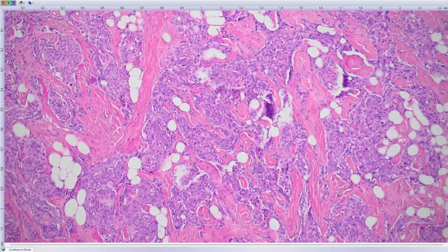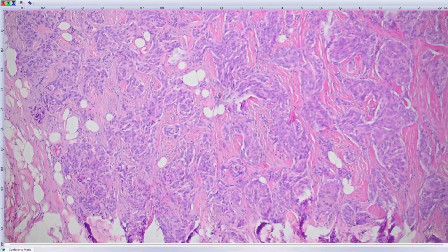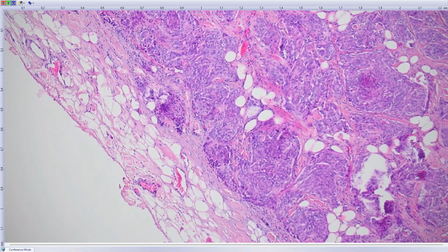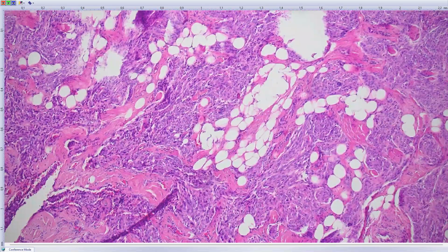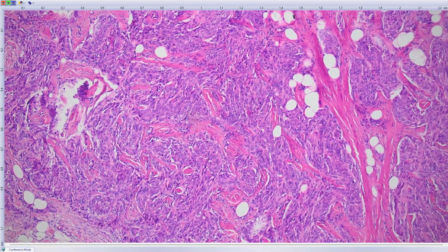But what is interesting here, you already see some fatty tissue. It's not metaplasia, it's growing outside the skull, okay? But it's a recurrent tumor. Maybe there was only some flap without complete reconstruction of the skull after the first operation. Okay, so meningioma, recurrent one, something between grade 1 and grade 2.